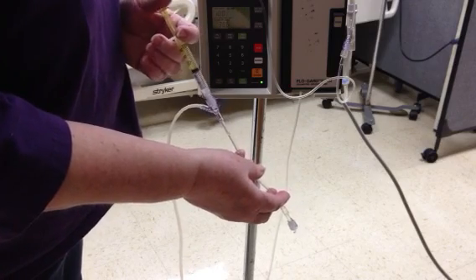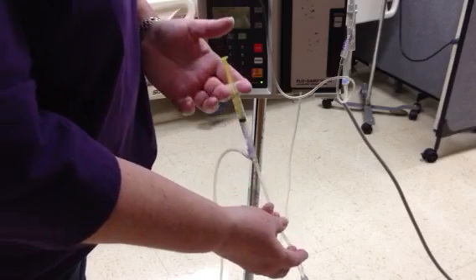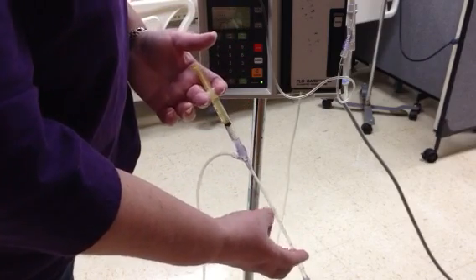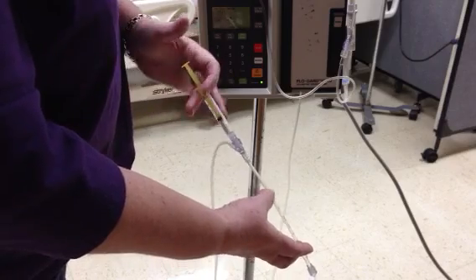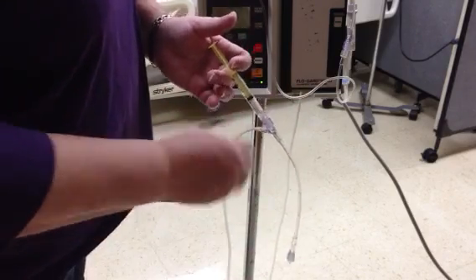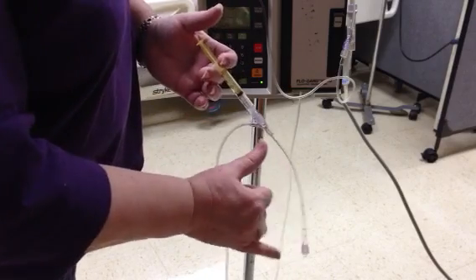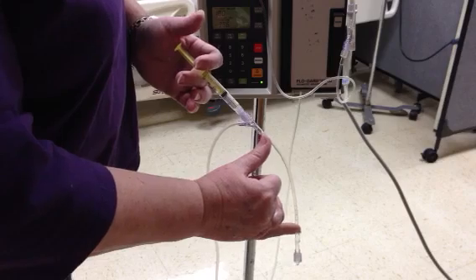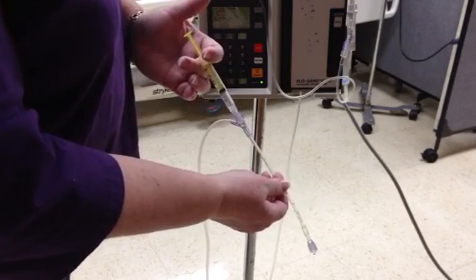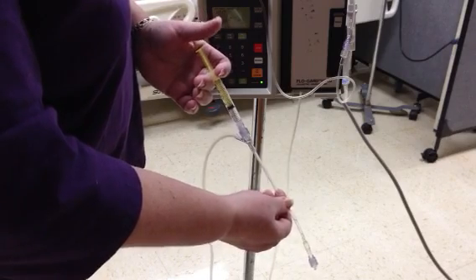and then again I'll push that one line every 10 seconds, saying that this is the same medication. So one line every 10 seconds. Now, every time I push a line, the pump is running, so it continues to infuse it. So as soon as I push that line, it goes on into the patient. It's not collecting here in the pump, in the line. So I push a line, wait 10 seconds, push a line, and wait 10 seconds.